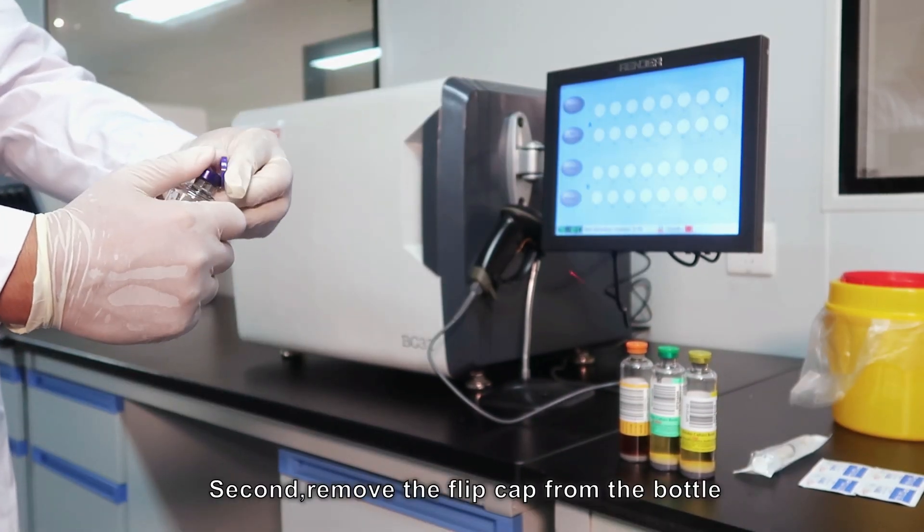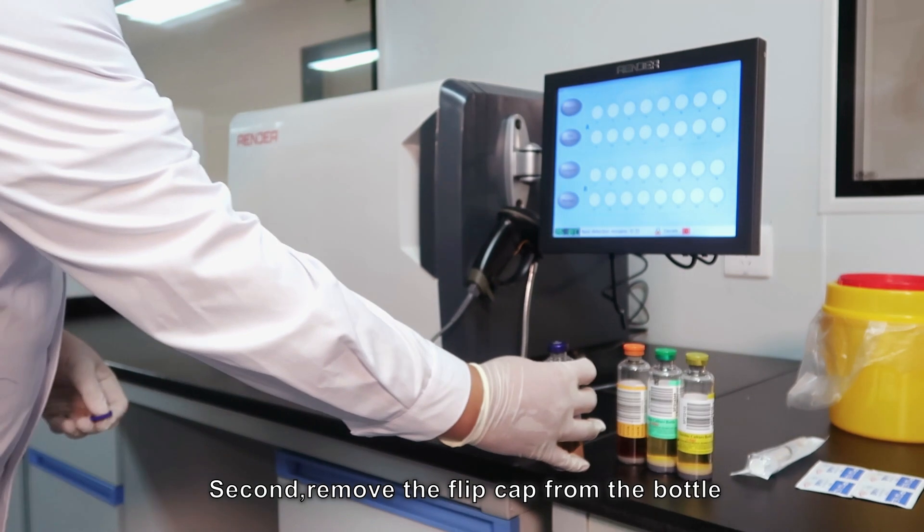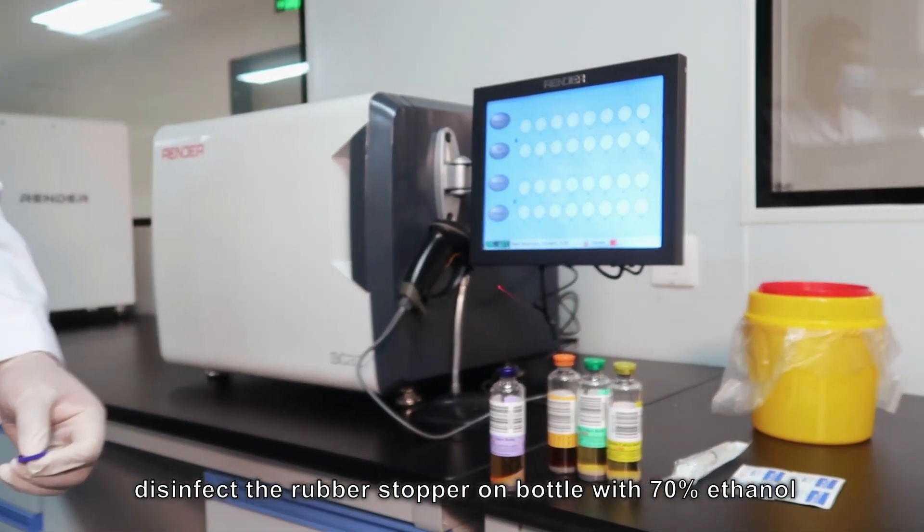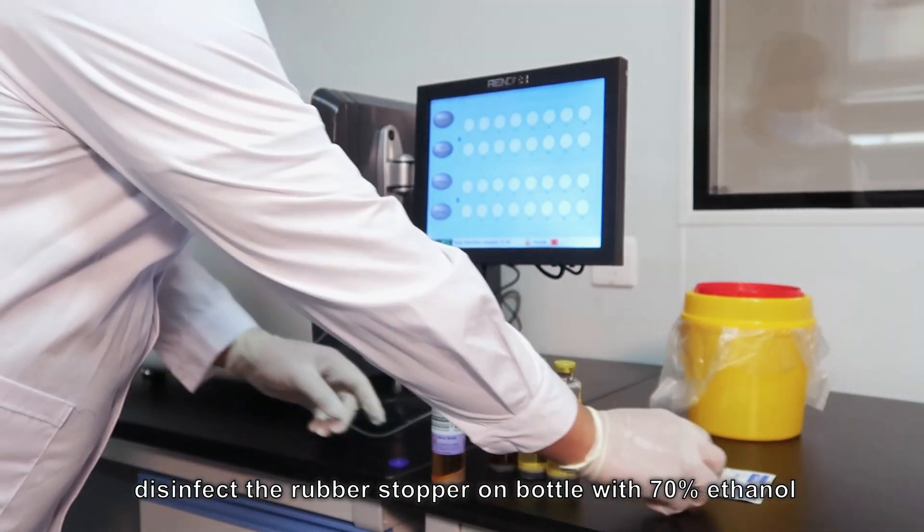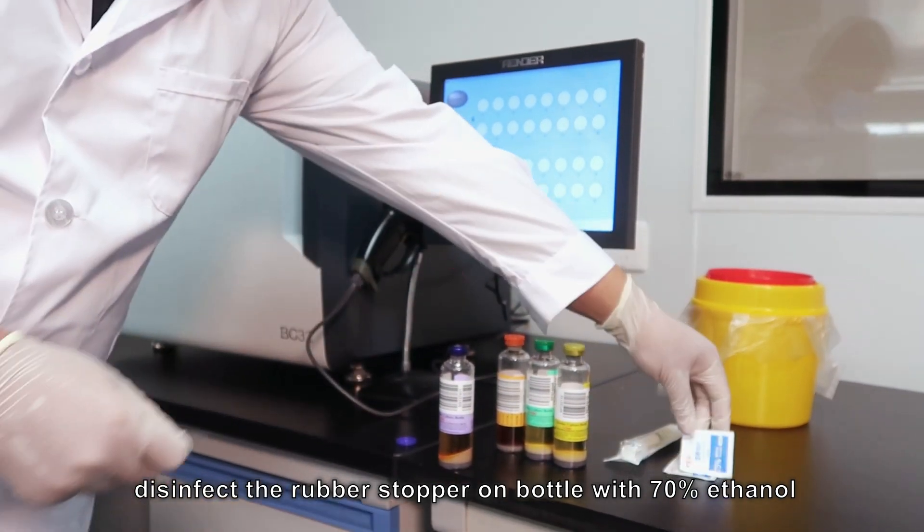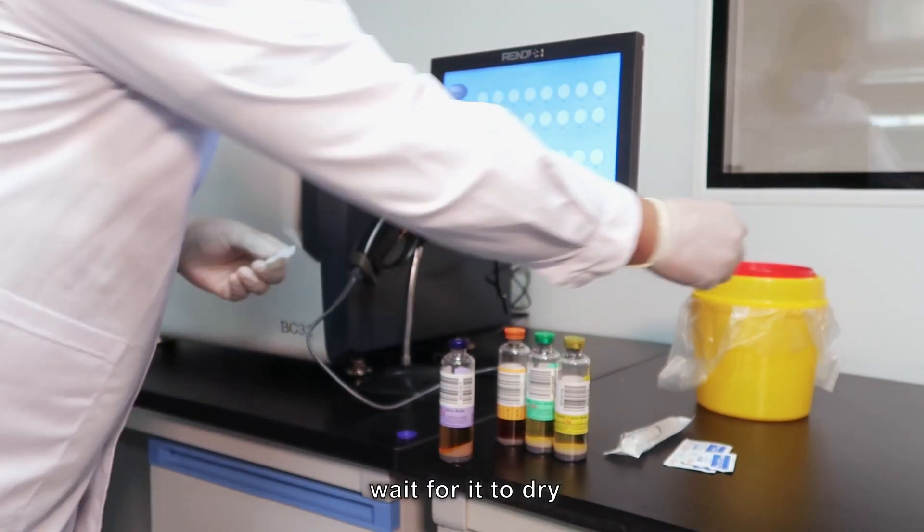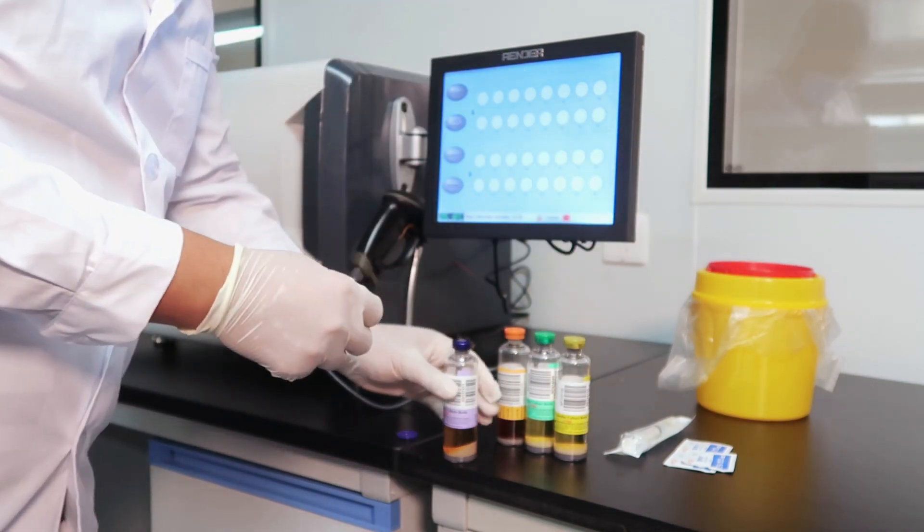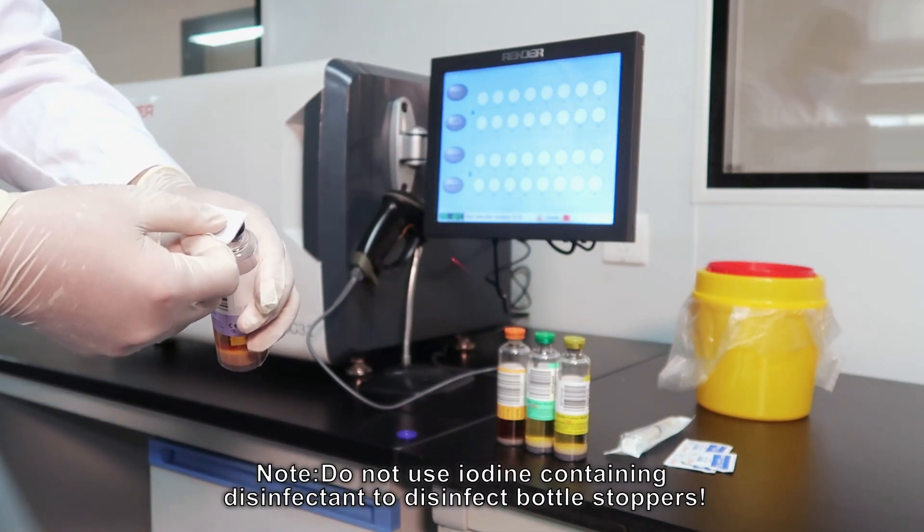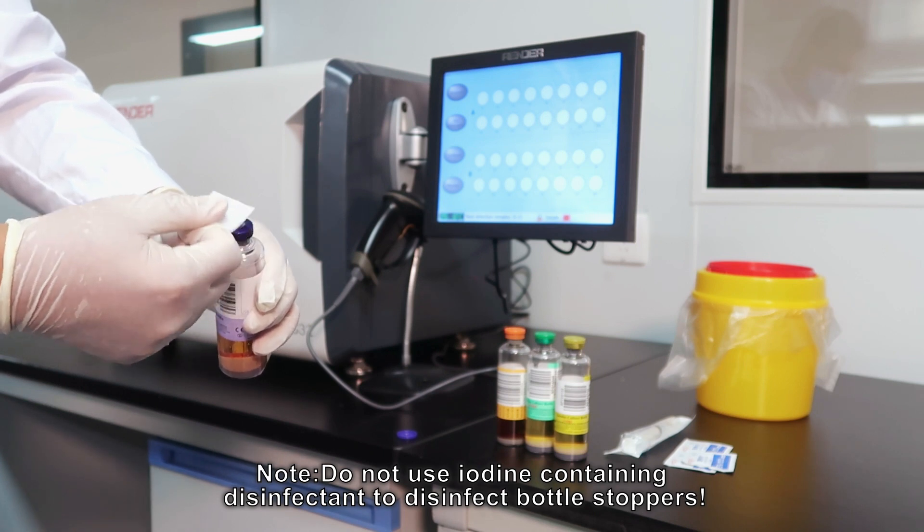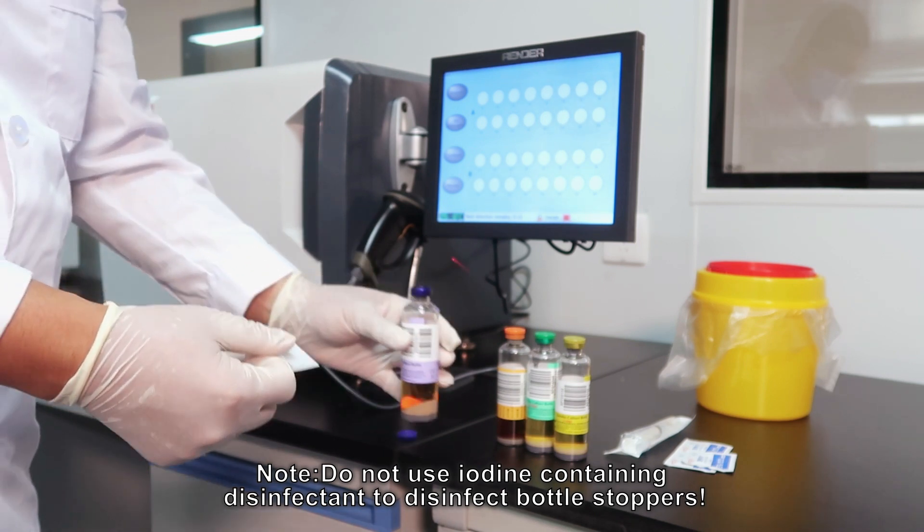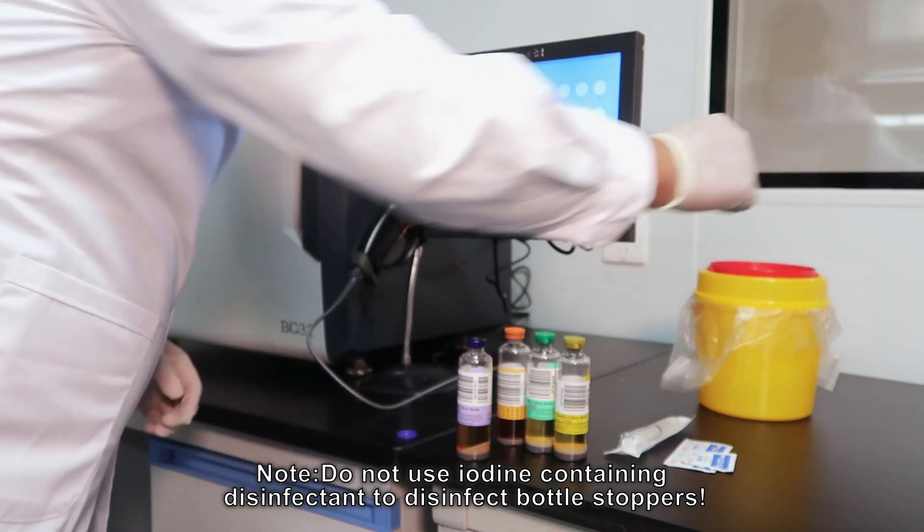Second, remove the flip cap from the bottle. Disinfect the rubber stopper on bottle with 70% ethanol. Wait for it to dry. Note: do not use iodine-containing disinfectant to disinfect bottle stoppers.